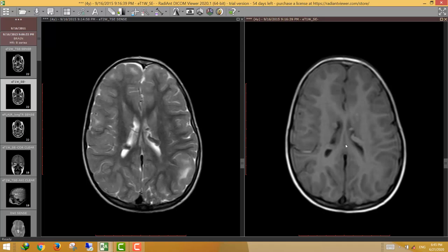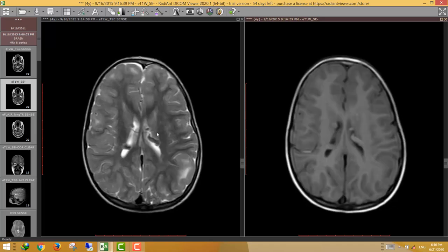Another way to differentiate between gray matter heterotopia and tuberous sclerosis is the orientation of the nodule in relation to the ventricular outline. If the nodules are perpendicular to the ventricular outline, as in this case, this matches tuberous sclerosis. If the nodules are parallel to the ventricular outline, this is consistent with gray matter heterotopia. Here the nodules are perpendicular — again consistent with tuberous sclerosis.